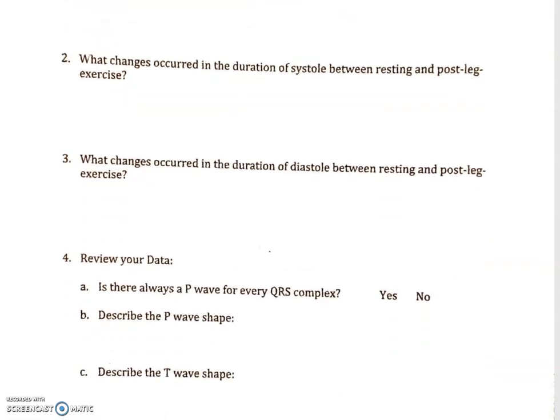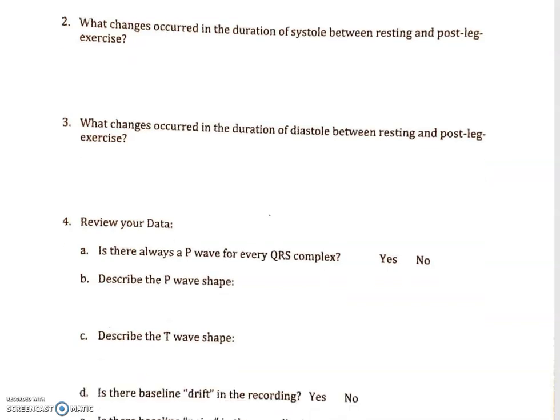What changes occurred in the duration of systole between resting and post-leg exercise, or any exercise for that matter? Systole does not change in exercise, not much anyway. So the change in the duration of systole between exercise and rest is not much at all.